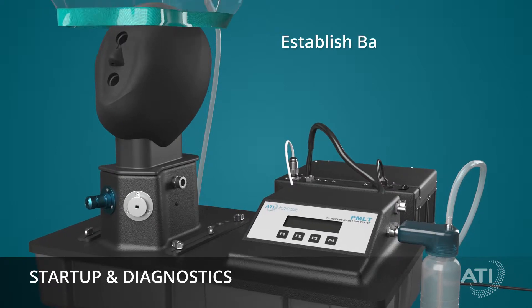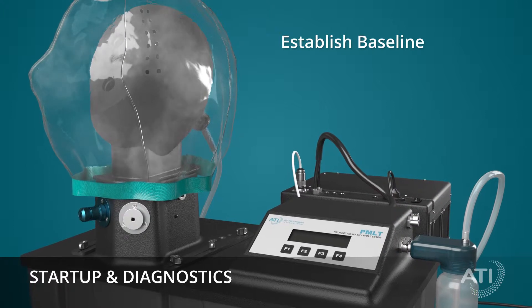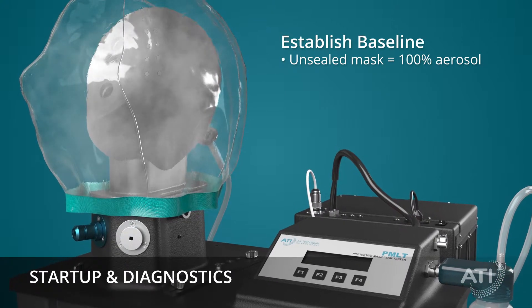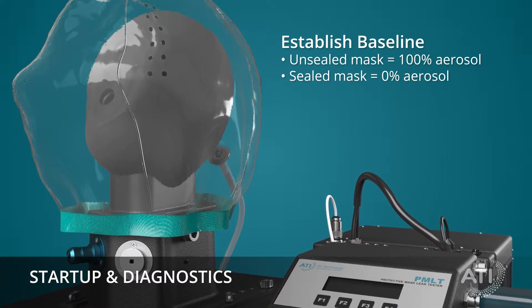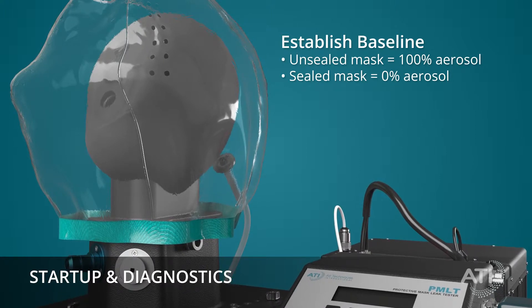With the tube inserted, the shroud is applied over the head form, and a fine aerosol mist is released. The PMLT establishes a baseline by measuring 100% of the aerosol concentration as if the mask was not sealed, then runs a sample of filtered clean air, establishing a reference for 0% aerosol, representing a fully sealed mask.